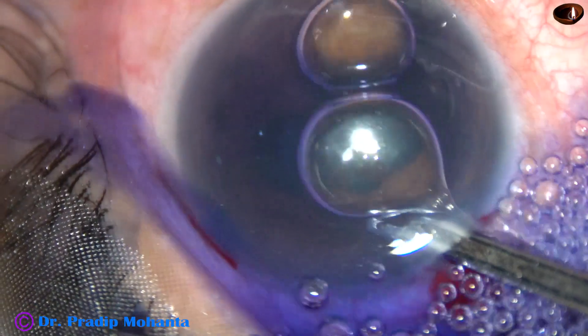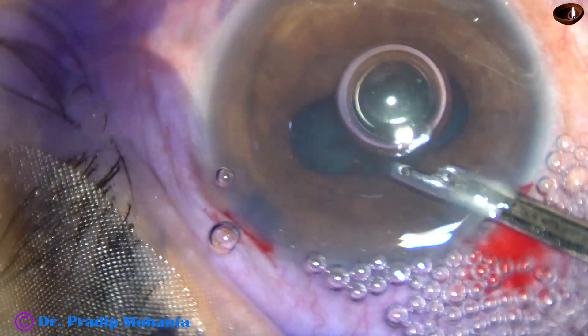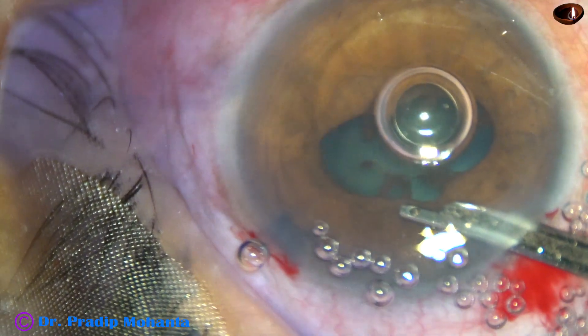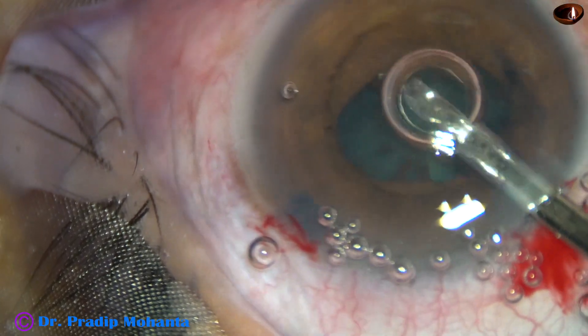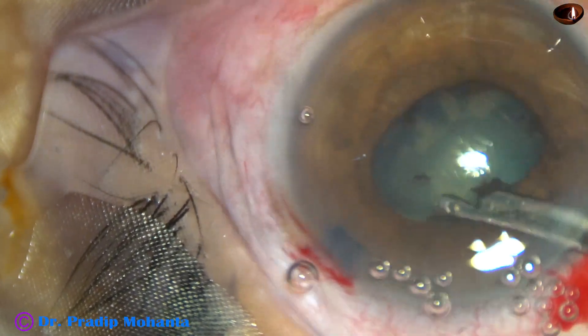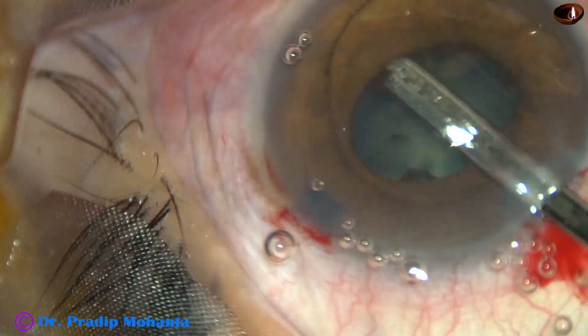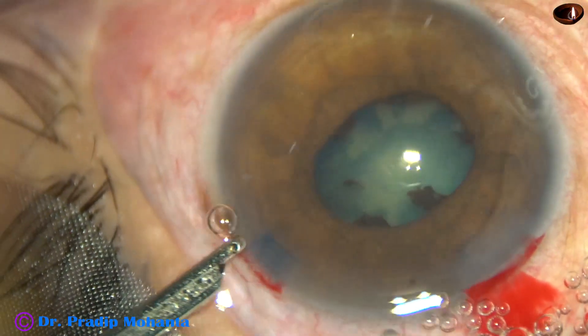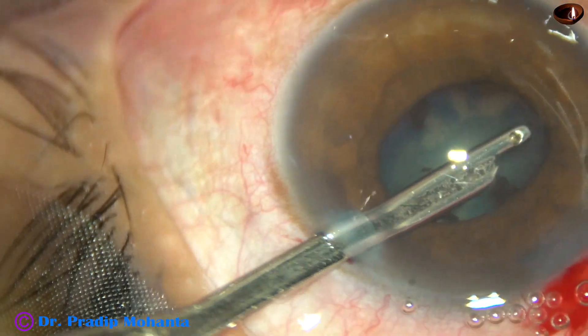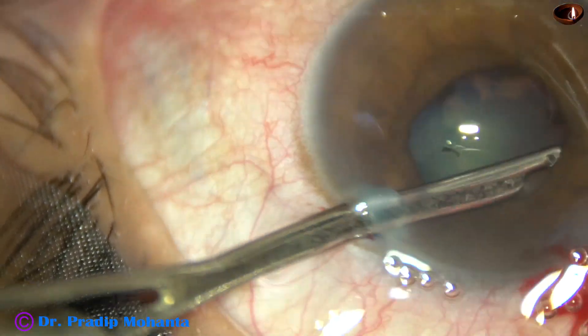Now the dye is washed out with BSS. This step should be done; otherwise, there will be a lot of trapped dye and blue behind the iris. You can see some unstained areas — those are the areas of synechia.